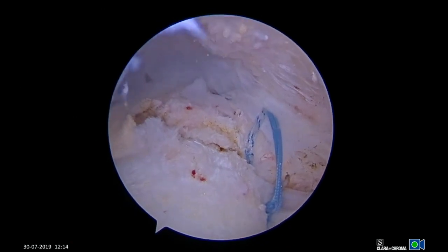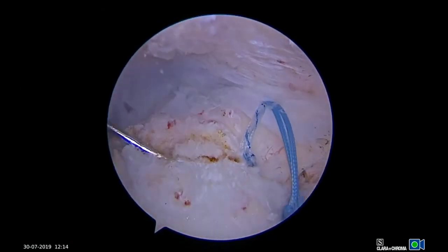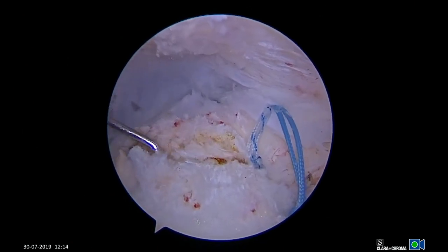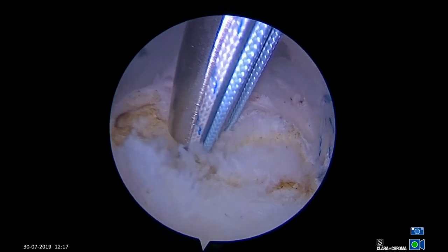The sutures are shuttled to an accessory portal for suture management, and a probe is then used to identify the remaining longitudinal split in the tendon. A second double-loaded anchor is placed through the split at the lateral footprint.